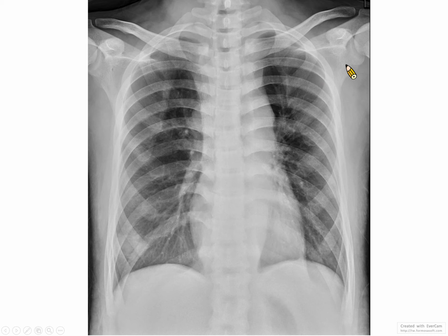The first thing is that you need to look at the lung fields and the heart, and also the diaphragm, the trachea, and the ribs. Maybe the first thing is that you need to scan the lung fields to see if there are any abnormal findings.